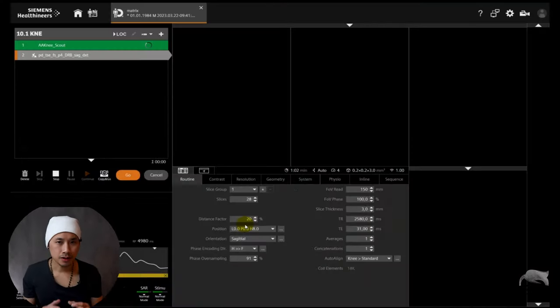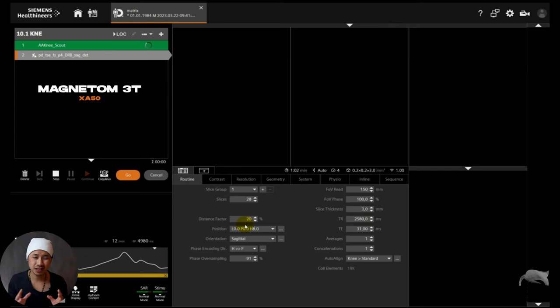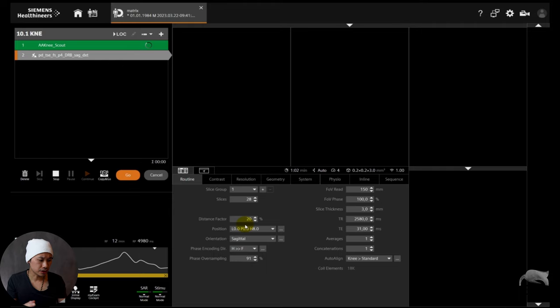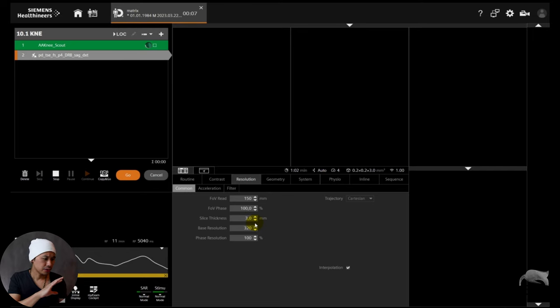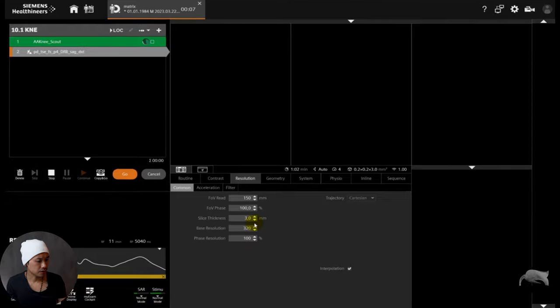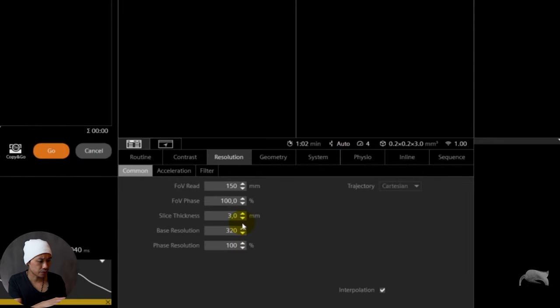At the beginning of the video I showed you the images — what I did and why the resolution is almost the same but the parameters are different. We are currently at the Magnetom 3T, but it doesn't matter — this applies the same to 1.5T and 3T across vendors. I'm using XA50 software here. Matrix is a basic concept across the vendors. We're going to do a simple scan — a knee — so we're going to do two scans with different matrix and different field of view, but in the end the resolution will be more or less the same.